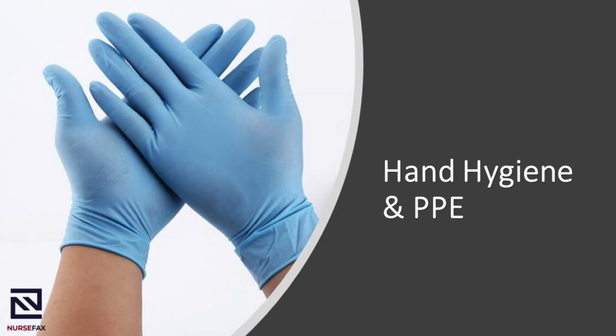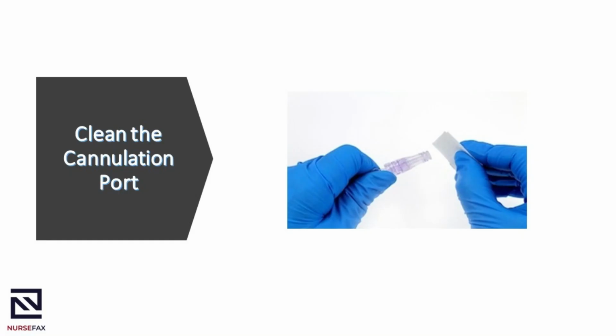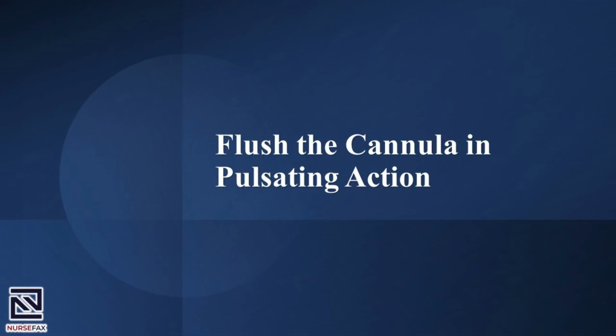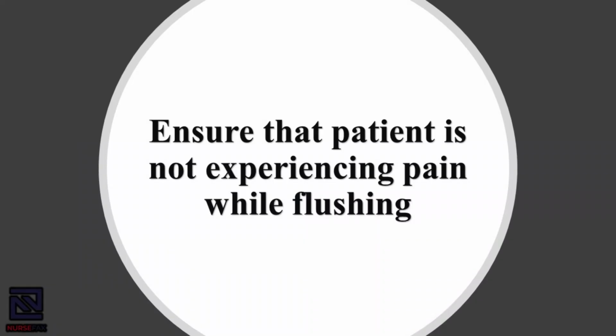Hand hygiene and PPE. Clean the cannulation port with alcohol wipes for 30 seconds and allow it to dry for another 30 seconds. Connect the loaded syringe to the cannula port using ANTT without touching key sites and key parts. Flush the cannula in a pulsating action. Ensure that the patient is not experiencing pain when you do this.